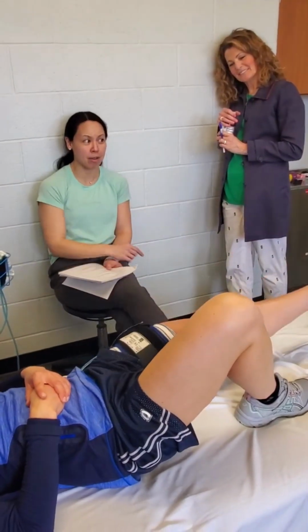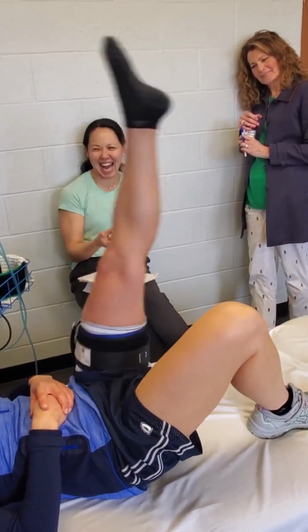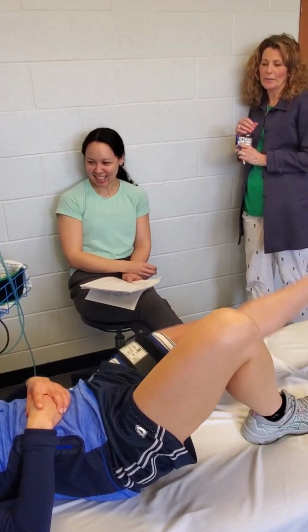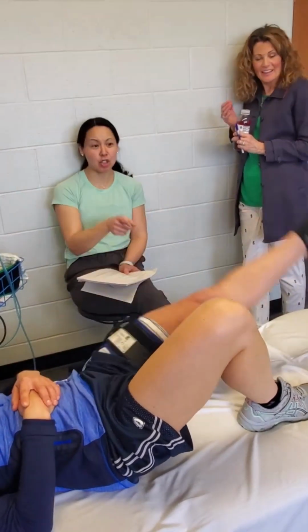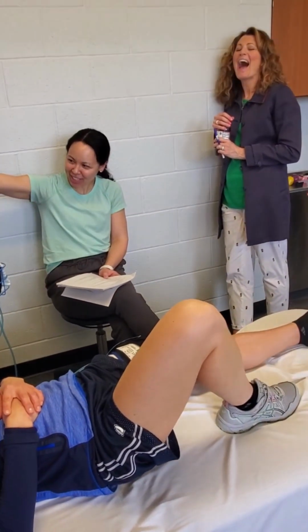And you feel the burn? Yeah, it's really hard. Where are you actually feeling it? Are you feeling your quad or your hip flexor? Mostly my quad. Really? Because she's doing a TKE at the cuff, right? Yeah, that's true. I mean, she's not doing how many have you done? I don't know. Okay, good.